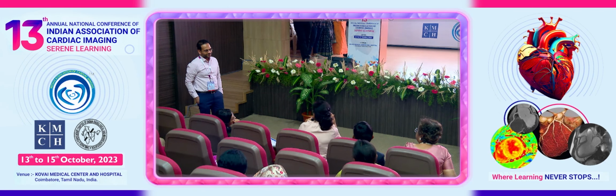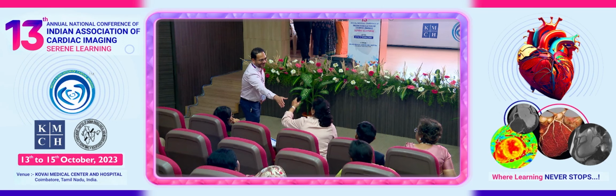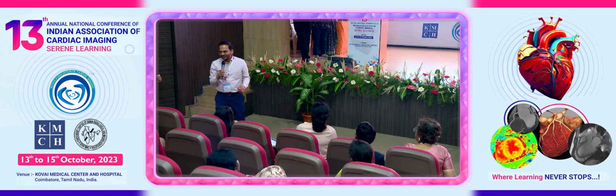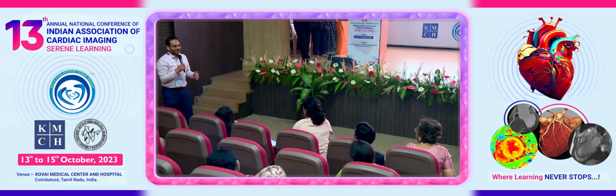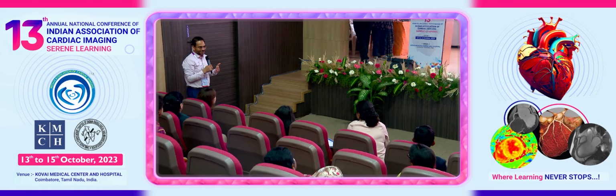So yes, it would make sense if it is a 75, 80-year-old who doesn't want to undergo CABG, you put a stent. But how long will this stent survive this much extrinsic compression? Because that thing is still there. Absolutely. You are only treating what you're seeing on images. You are not taking away the potential etiology that is causing the compression.